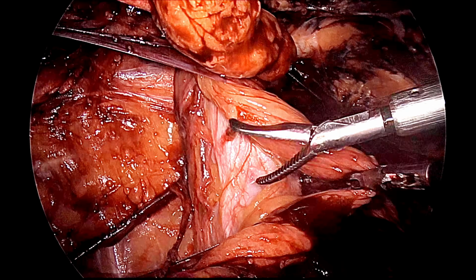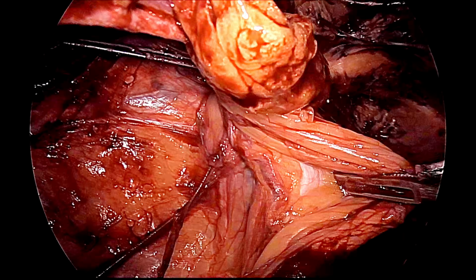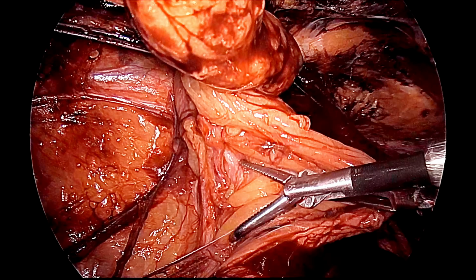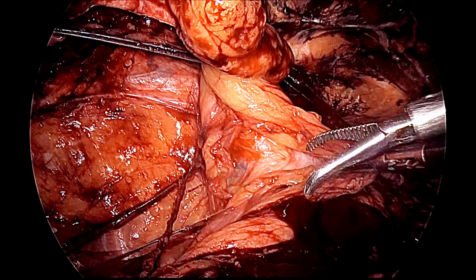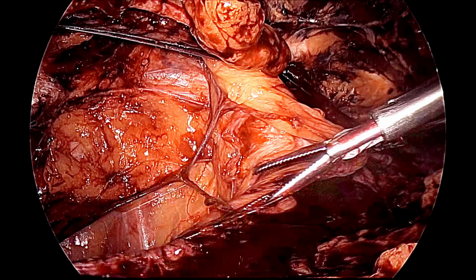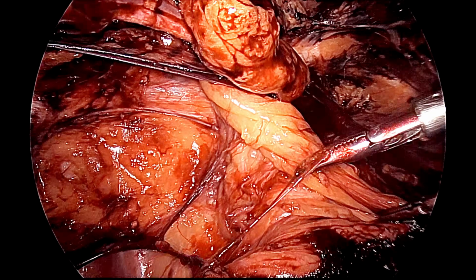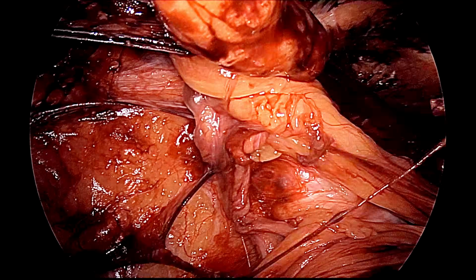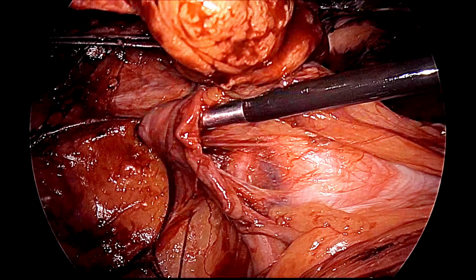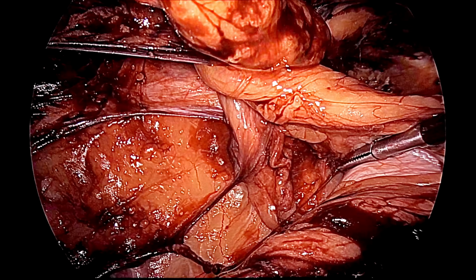Any hook or any sharp scissors or any harmonic should be avoided, because in between the vas and the spermatic vessel there will be the iliac vessel. So, that is why it should be a very careful dissection. We also should take care that when you are pulling the sac, there should not be any buttonhole in the sac, because if you make a buttonhole, then the problem will be that all the gas will enter into the abdominal cavity and a pneumoperitoneum will be formed.